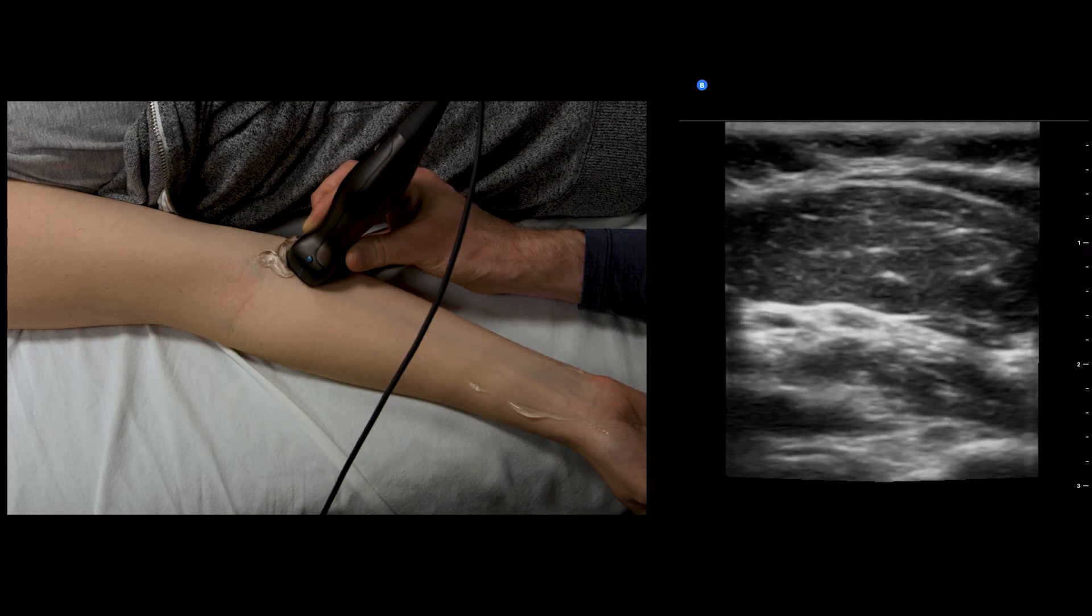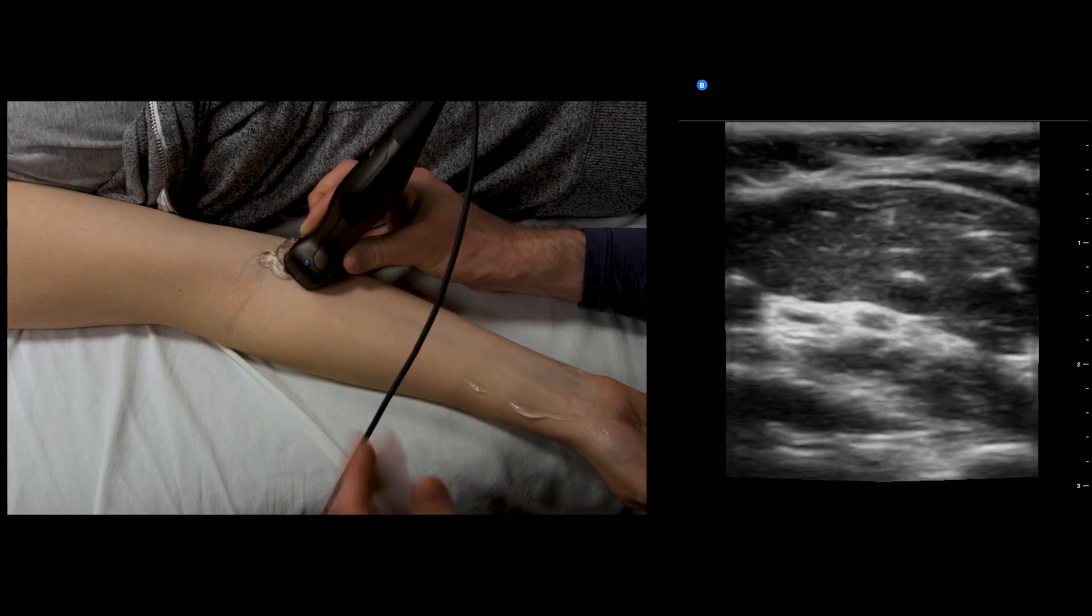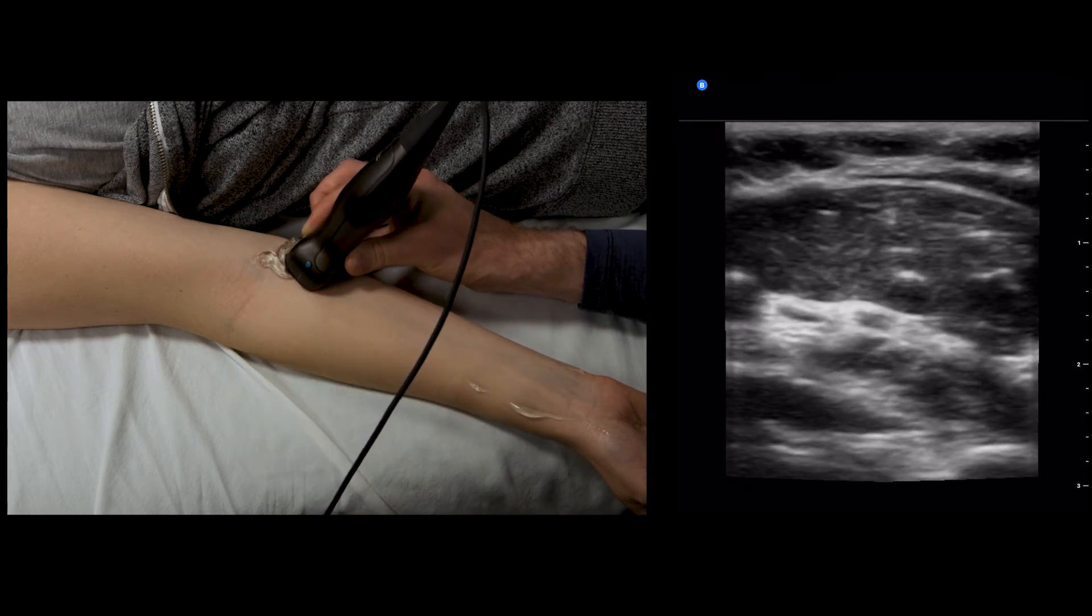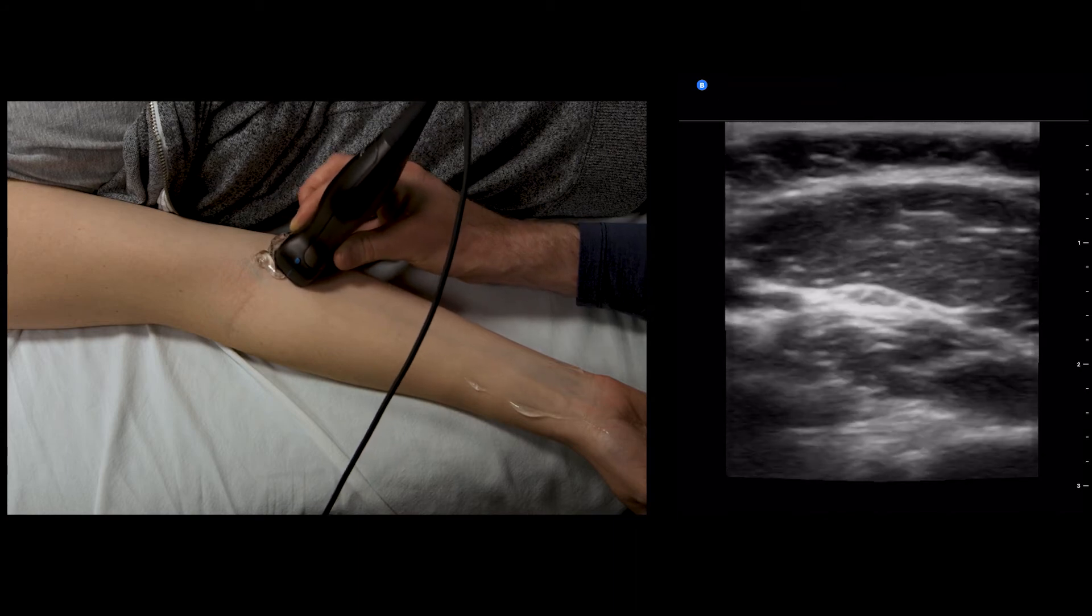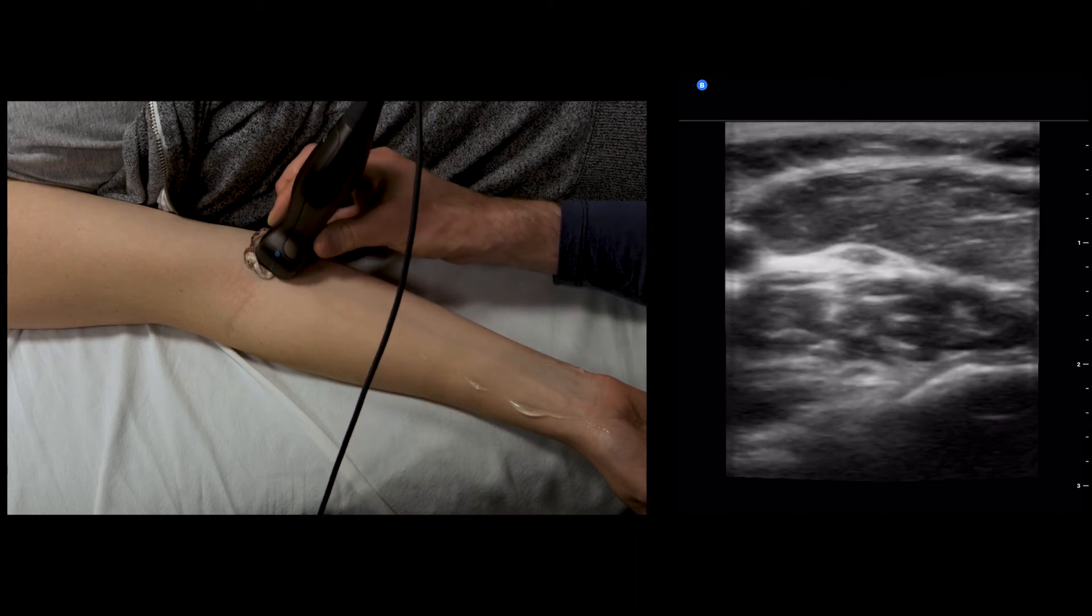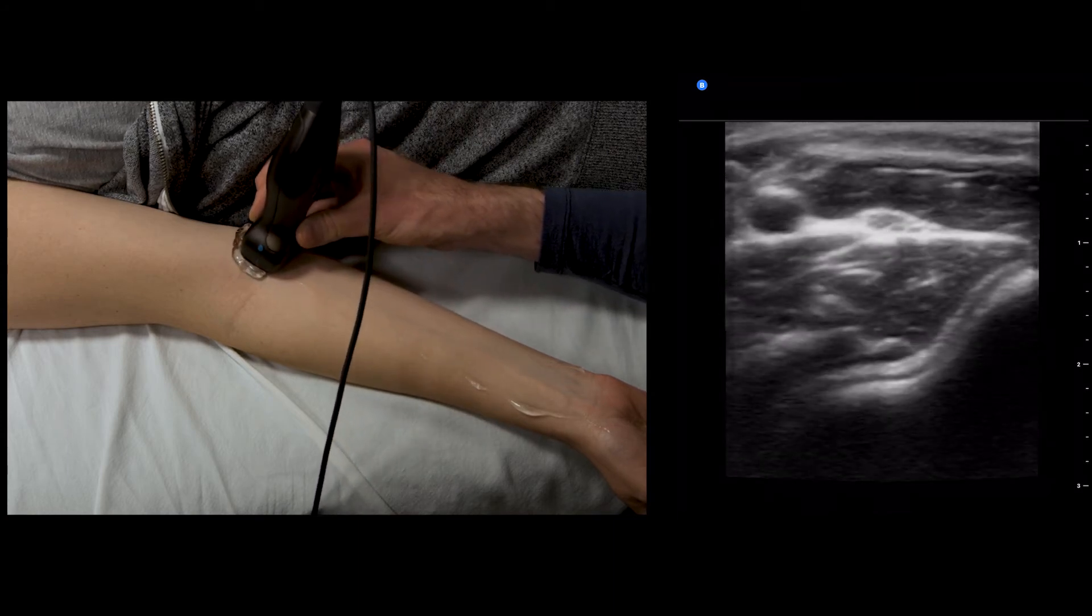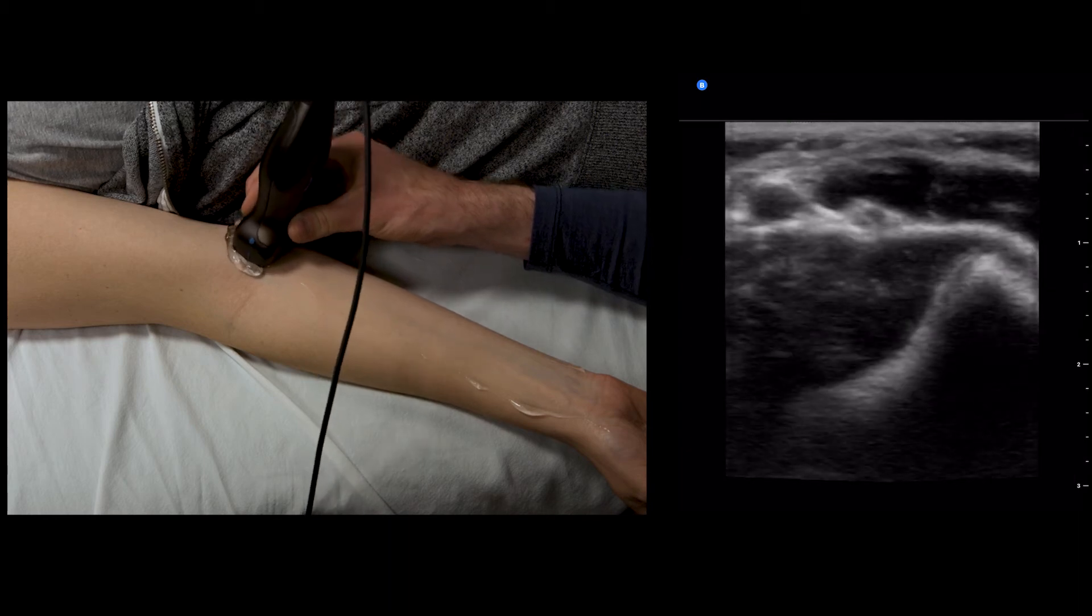The median nerve is going to go superficial again, so now we're wagging our transducer again so we can visualize the median nerve, and then follow it up to the level of the brachial artery.